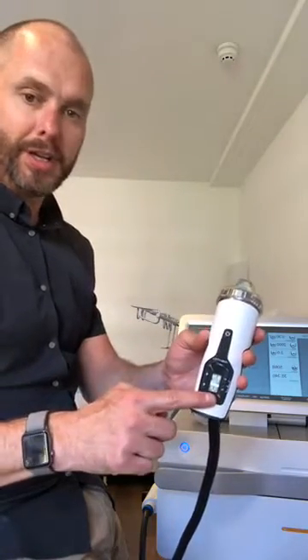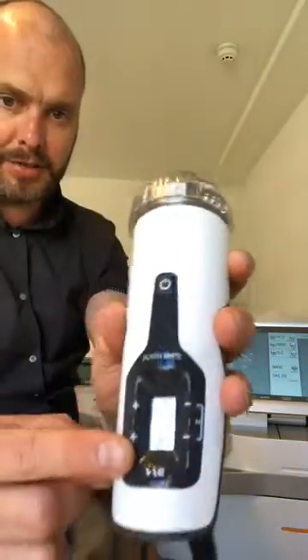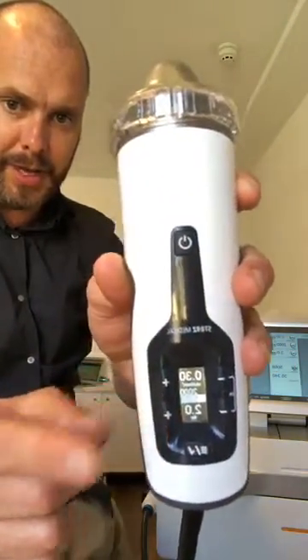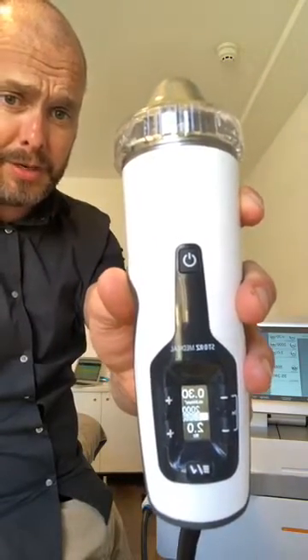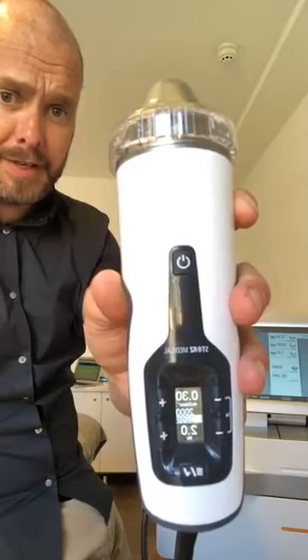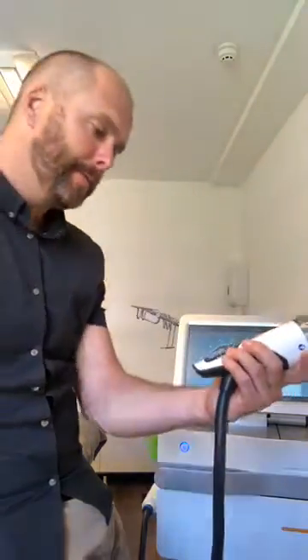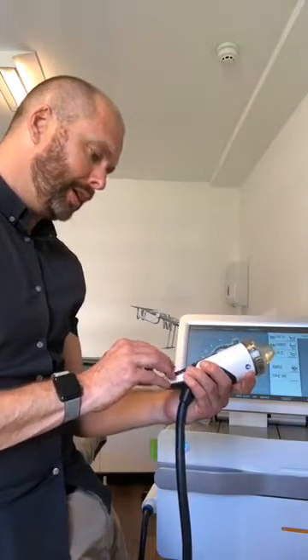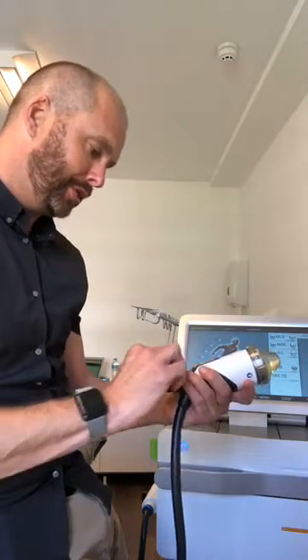The on/off button is up here, and that's an important part to note because you don't want to be pushing this button down here and get that wrong. And the settings — you'll see the numbers. If you're used to using radial shockwave, it's very, very different indeed. We've just got a 0.30 and just a 2 on the hertz, and we're looking at 2,000 shocks.